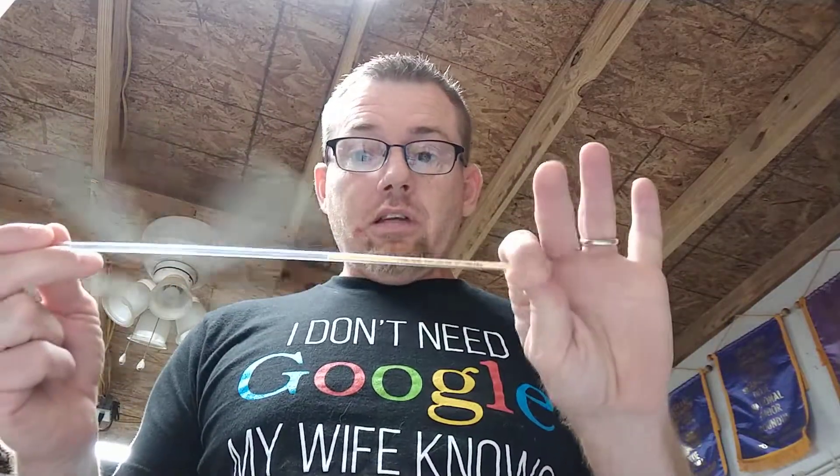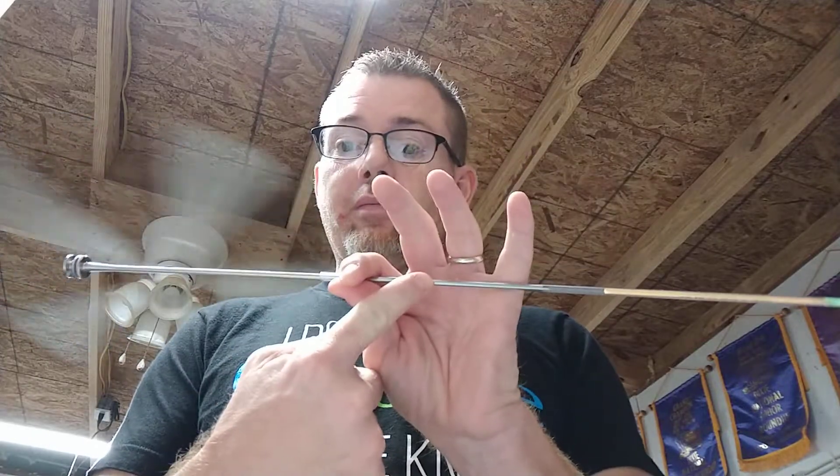One thing we do when I have help — if Kenny's there — when Jenny and I are both here, she and I insert, we get through the rings, then we put the straw in. If Kenny's there, get him to hold the doe, then you insert, get through your rings.